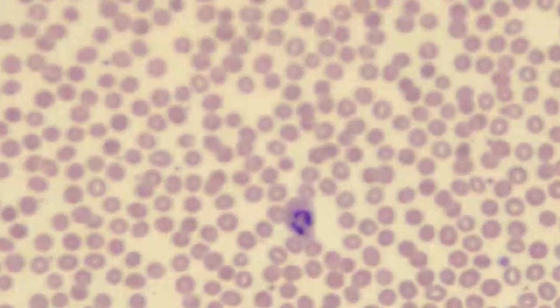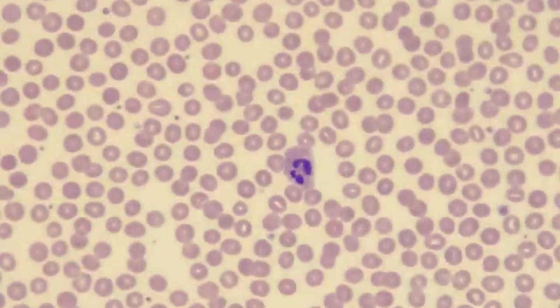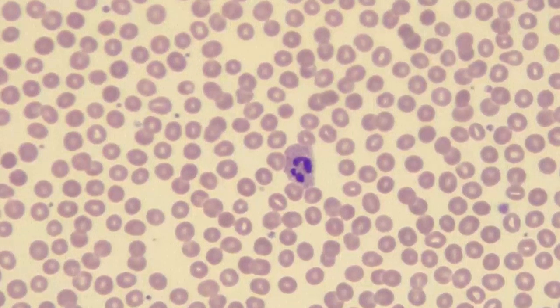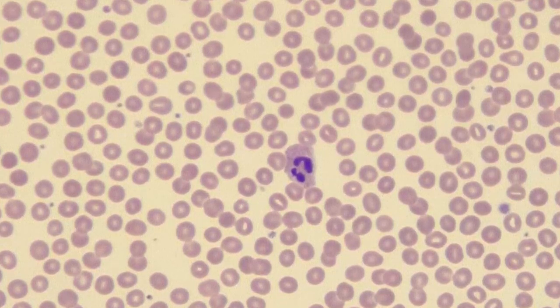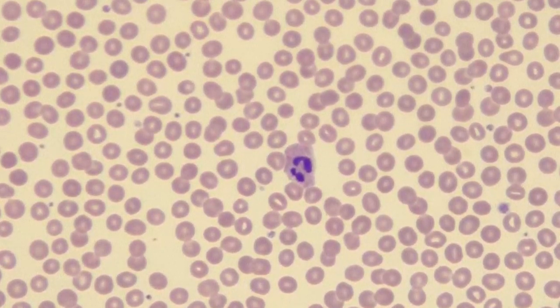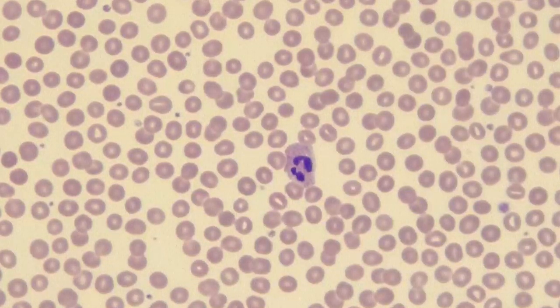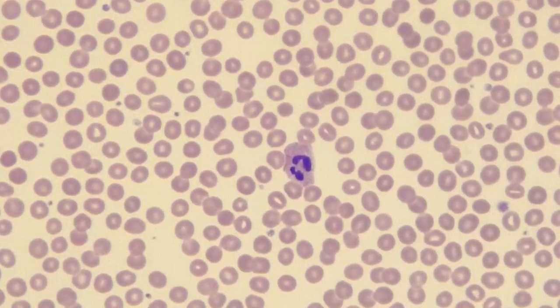Now, when it comes to assessing white cells, for example, this neutrophil, the nucleus in an individual white blood cell is going to be a deepish purple or deep blue, and depending on what type of white blood cell it is, it's going to be fairly compact. And the cytoplasm of a neutrophil is going to be kind of a pinkish, purplish color. And for me, this particular neutrophil looks pretty good. Let's go around and see if we can find some other cells.